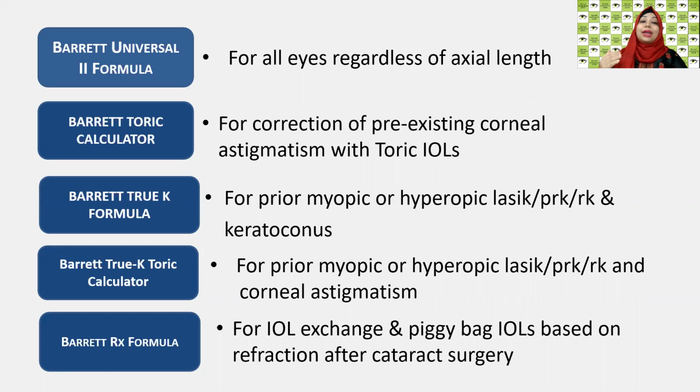This is used. And only last year, Dr. Barrett has improved this formula by making it the Barrett True K TK formula. Now the total keratometry is being used here. So this formula can now be used for biometry of keratoconus eyes even. So this is very important.